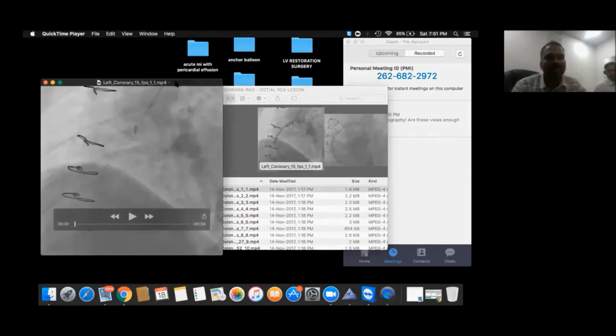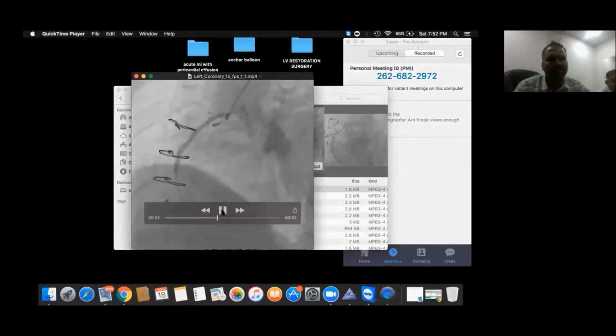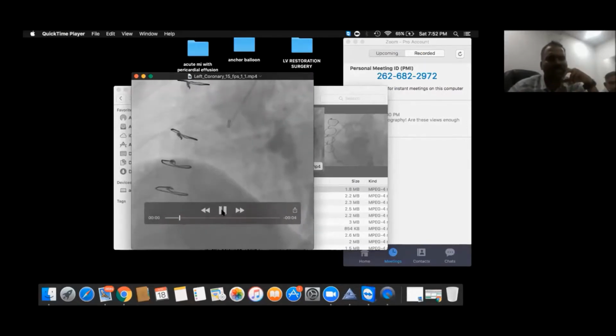Are you able to see? Yes. Yeah, I'll play now. See if you can give a commentary.